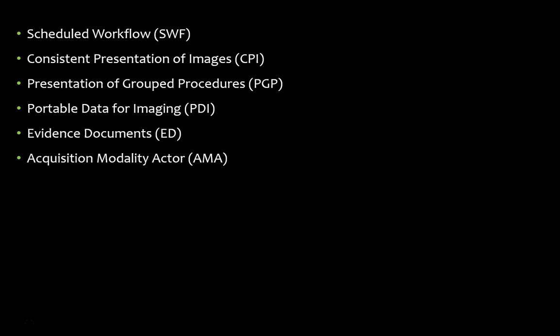SWF is the cornerstone of IHE integration for the acquisition process. It establishes a seamless flow of information that supports efficient patient care in a typical imaging encounter by specifying transactions that maintain the consistency of patient information from registration through ordering, scheduling, image acquisition, storage, and viewing. It's strongly recommended you start with this profile.